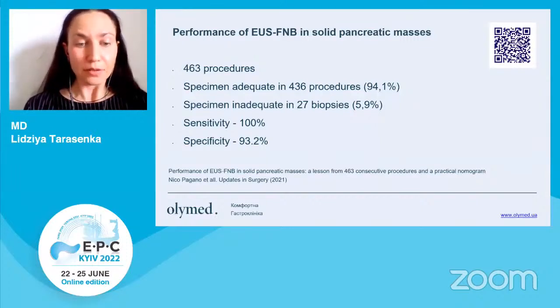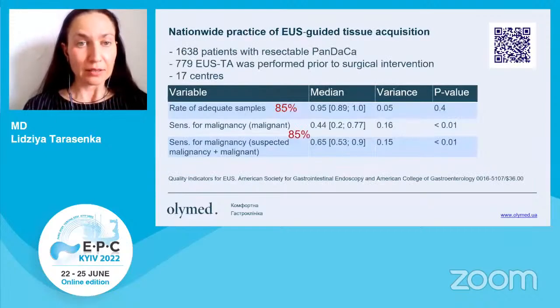Great, but usually such studies are done by expert centers, and there is a high level of suspicion that in real life scenarios there are differences. And as evidence, I'd like to mention this study from Netherlands, which gives us an interesting view of the variability of EUS tissue acquisition.